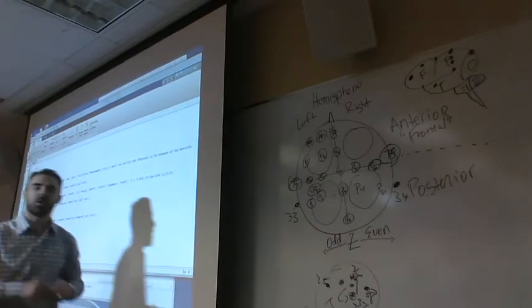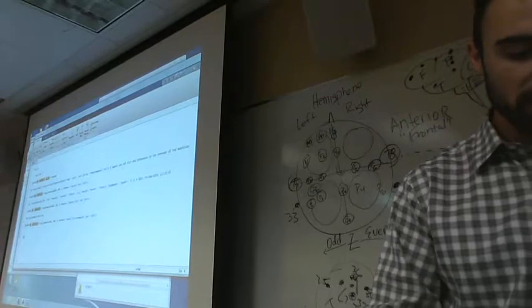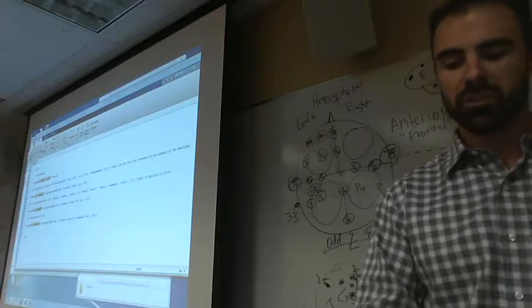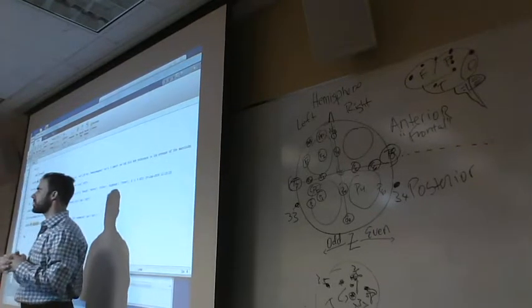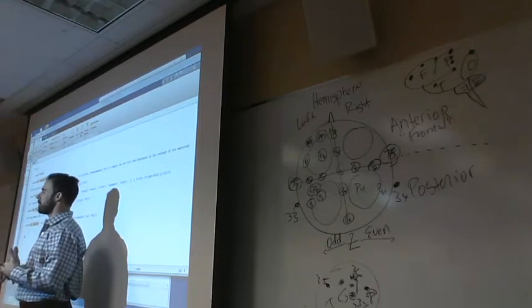So we need to take this number and turn it into a string, which is just a goofy command that we use. It looks weird, but it actually makes a lot of sense. It's called num, N-U-M, the number 2, and then str for string. Now here's the thing, we're not done yet. Yes, ma'am? What's after the subject? The equal sign. Just like the first day in class when we said C equals 5, Z equals 100. We're just defining something.